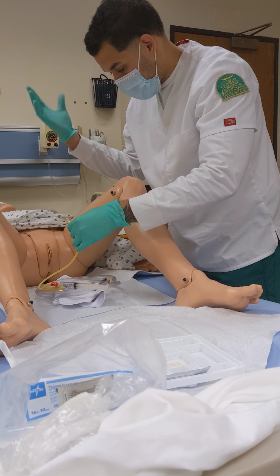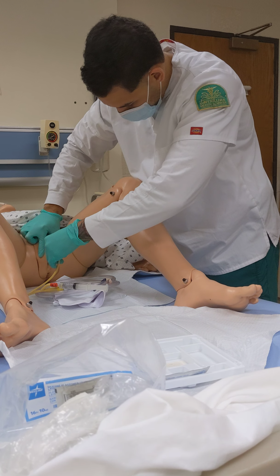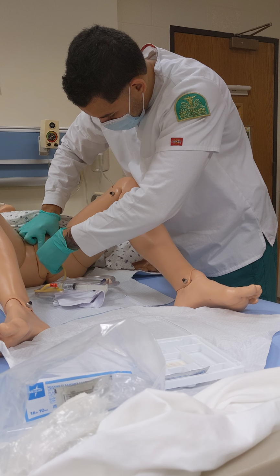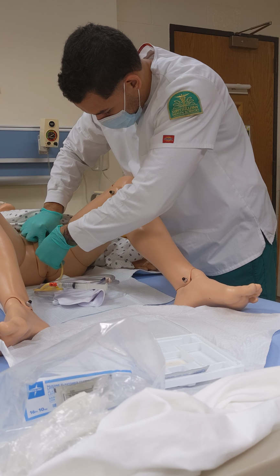With my non-dominant hand, I'm going to keep it placed here on the perineal, the vagina, so that I can spread the lip to then insert the catheter.